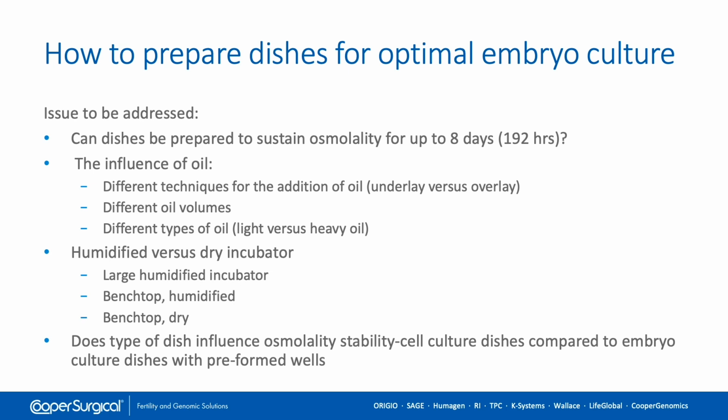There are 3 types generally on the market: those large humidified box incubators, a benchtop incubator which is humidified, and also now a current trend to move towards benchtop incubators which are dry. If these are the ones that are used in your laboratory, then it is even more critical that the correct volume of oil and the type of oil is used.